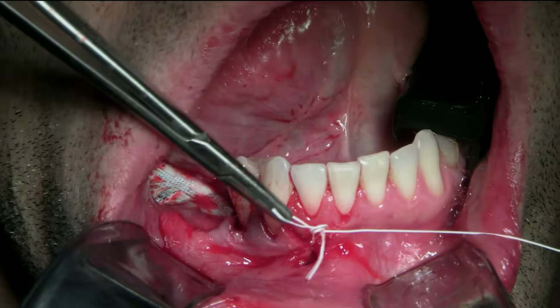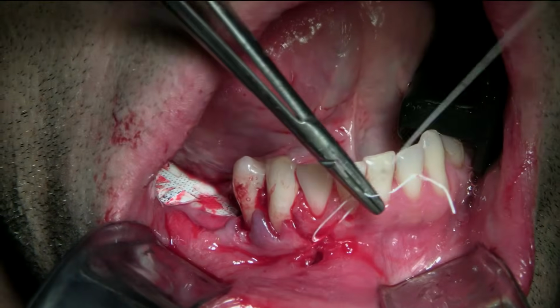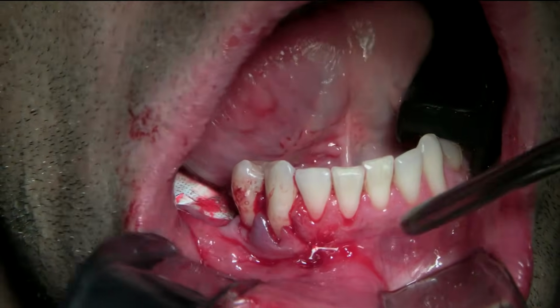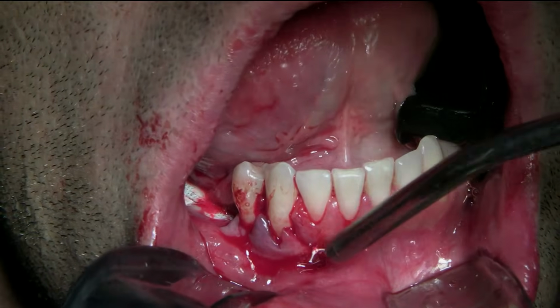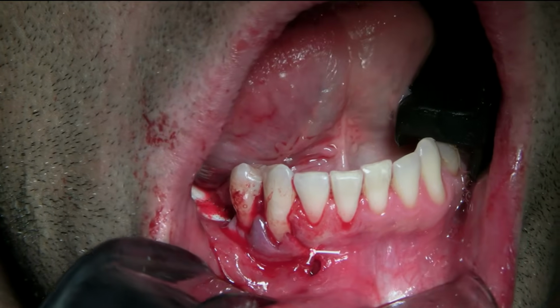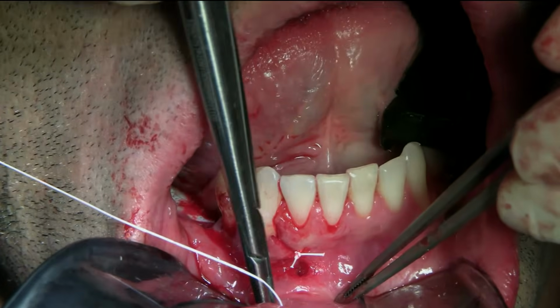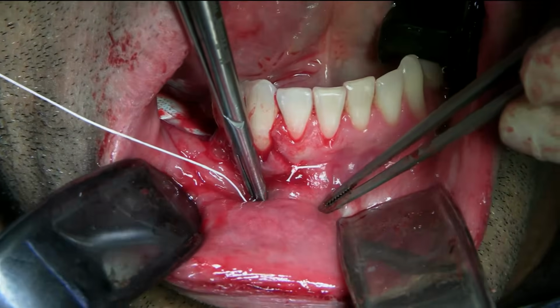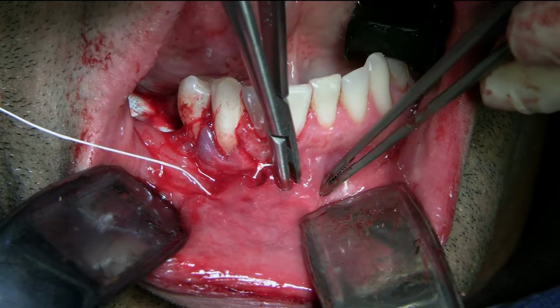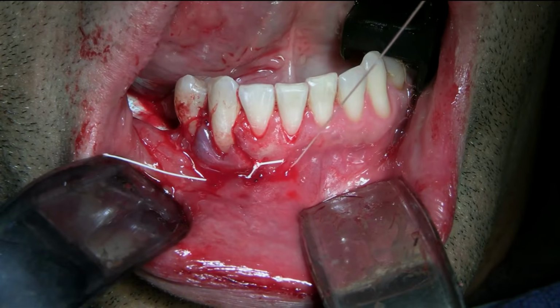So 2, 1, 1, 2. Do more at the bottom. So that's the same suture that I will use on the crest. That's the 3-0 cytoplast.